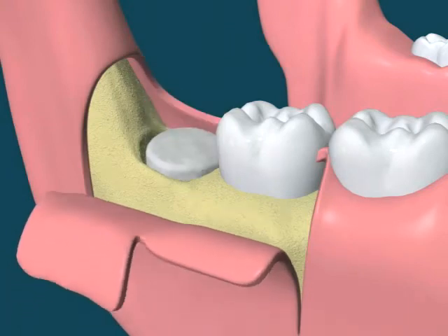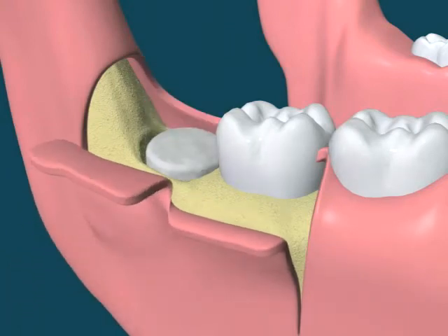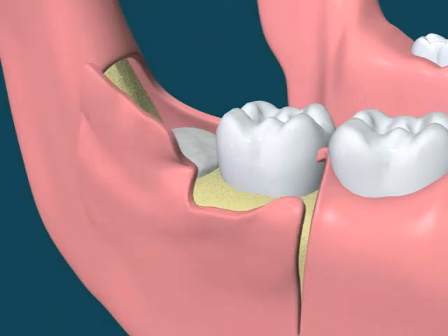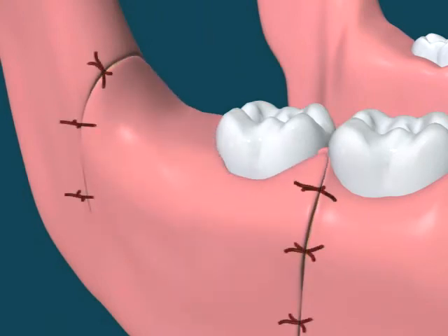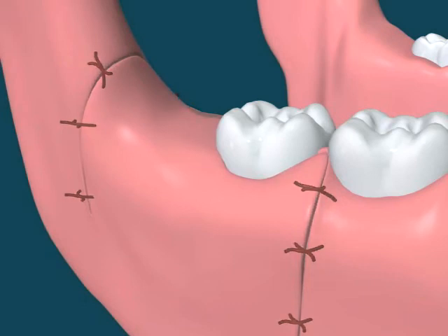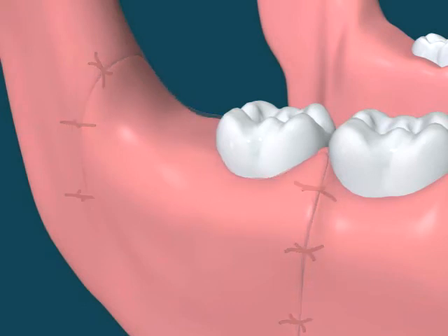The gums are sutured back. Wisdom teeth are third molars that usually appear between the ages of 16 and 24. They are commonly extracted when they affect other teeth or erupt the wrong way, also known as impaction.